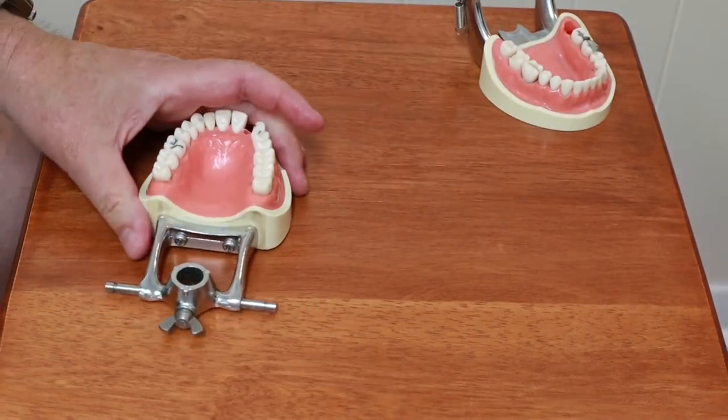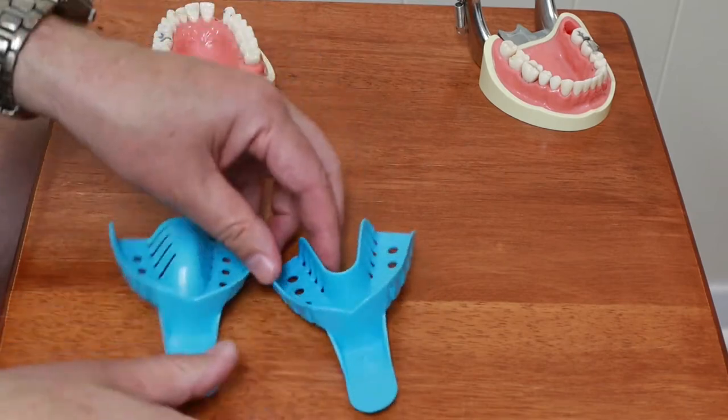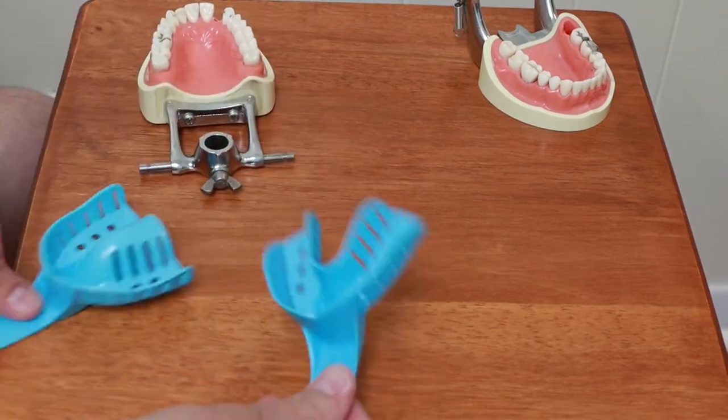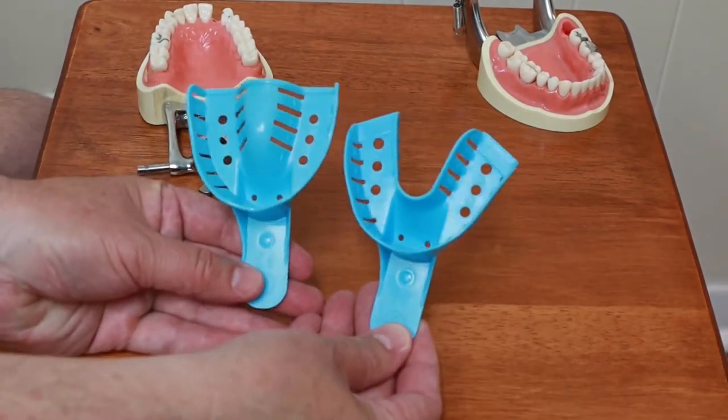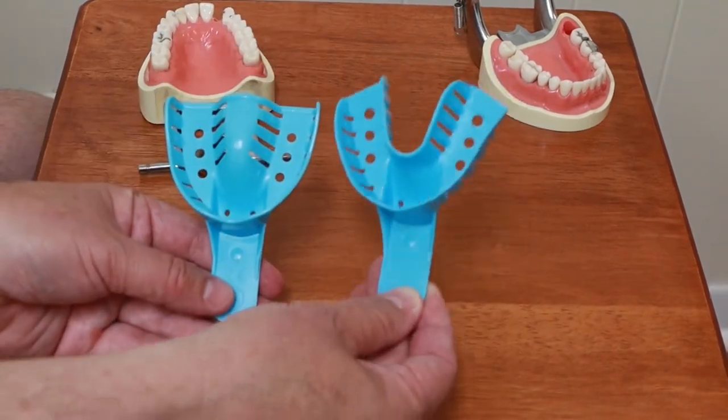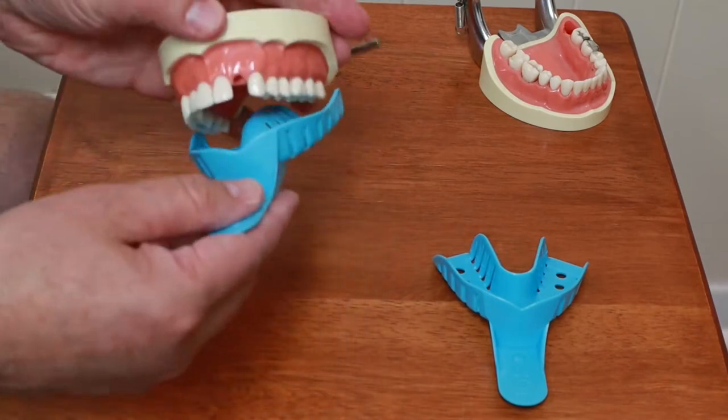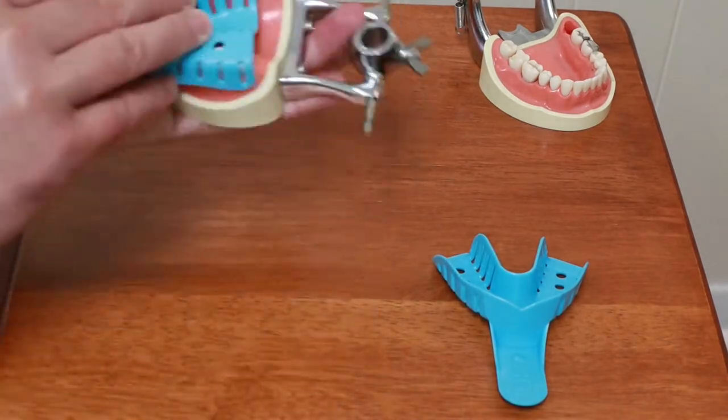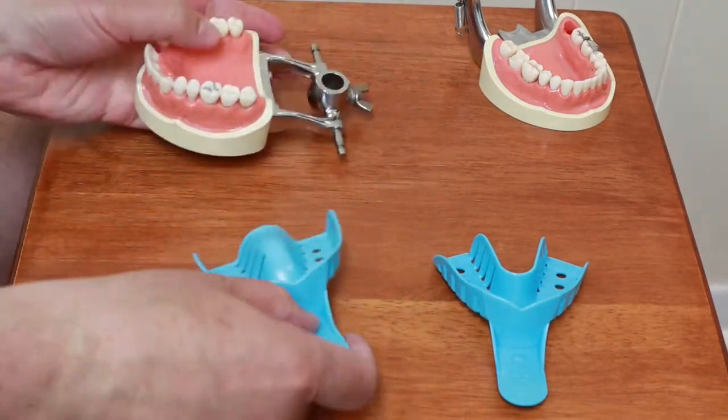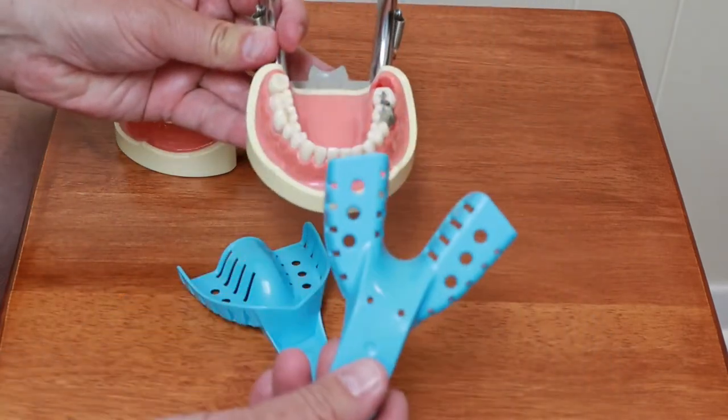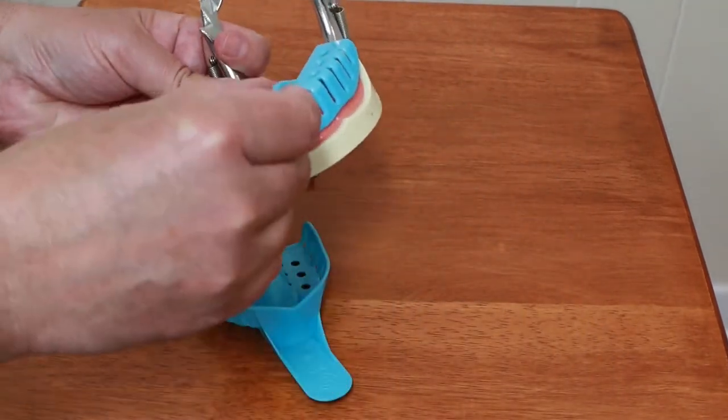For these molds I'm going to use stock impression trays. This is just medium sizes, a medium upper tray and a medium lower tray. Let's just try them in, make sure they fit. Yes, they do. And the lower one fits well as well.